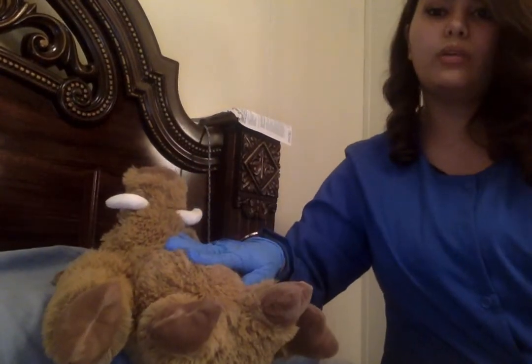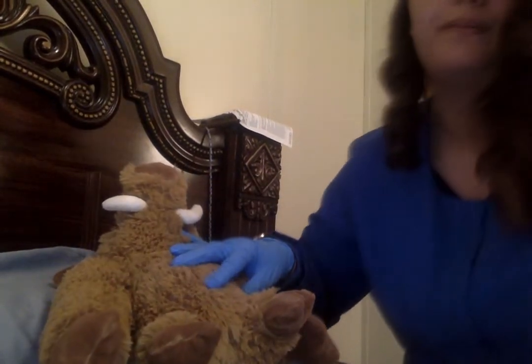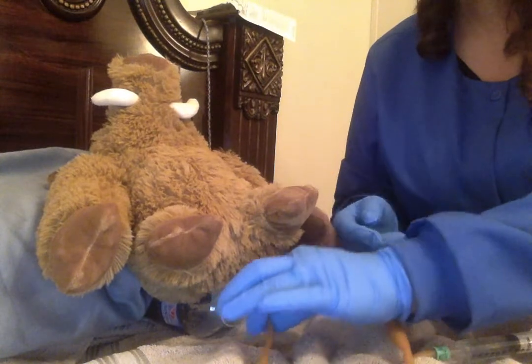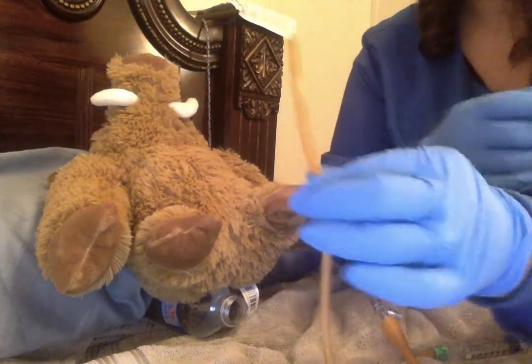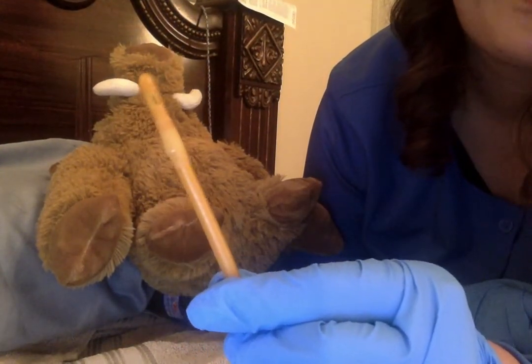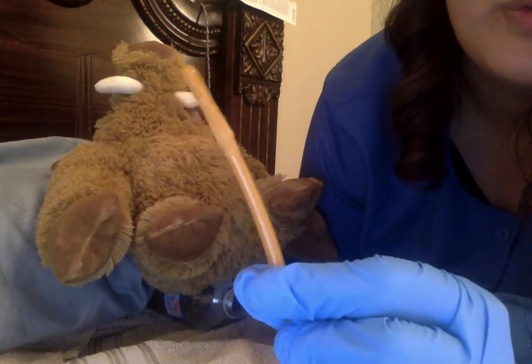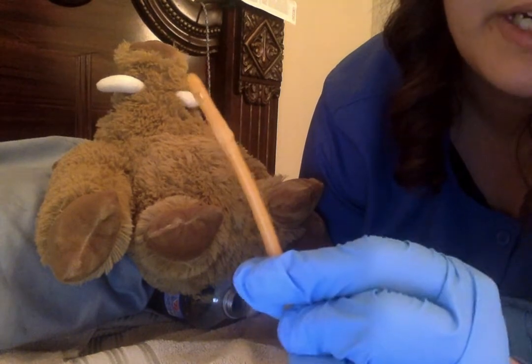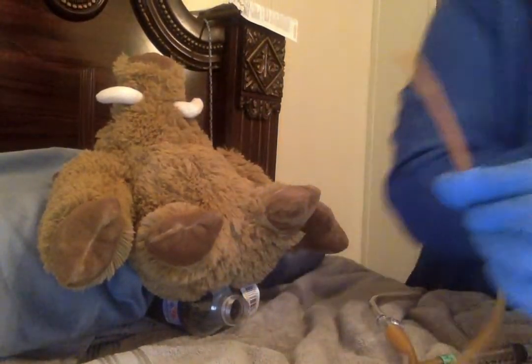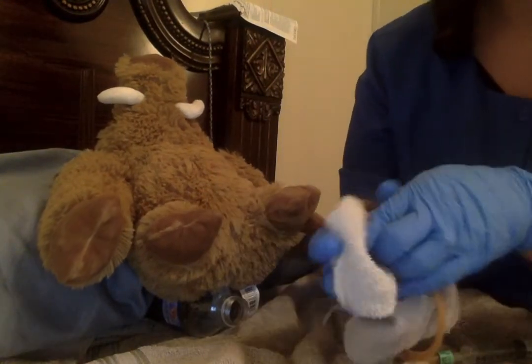So now we're going to tell our patient, okay, it's time for you to exhale slowly, and we're going to pull the catheter out smoothly and slowly. So we're going to go ahead and pull our catheter out. We're going to look at our catheter, and we are going to make sure that the catheter is still intact. Once the catheter is removed, we're going to wrap the contaminated catheter in a waterproof pad. We're just going to pretend this towel is a waterproof pad and we're going to wrap it up.